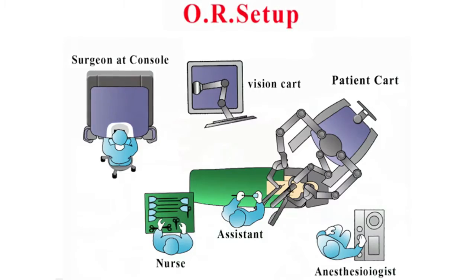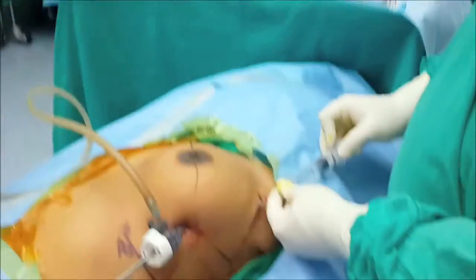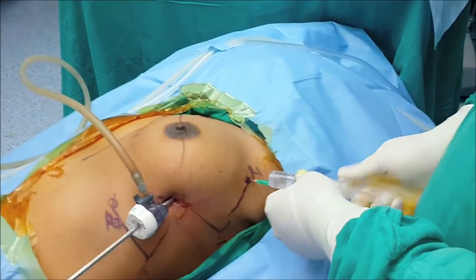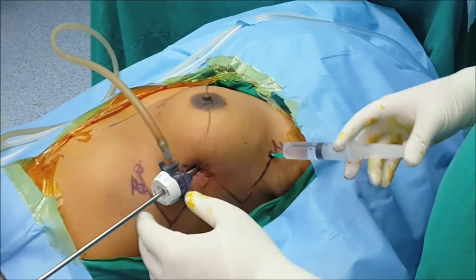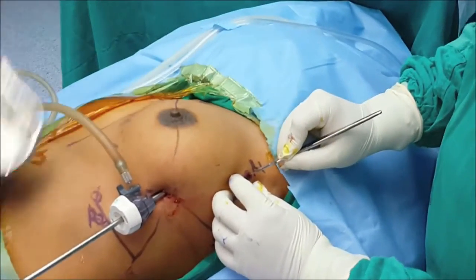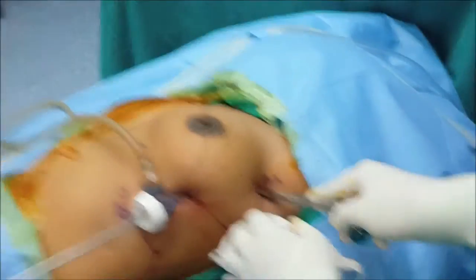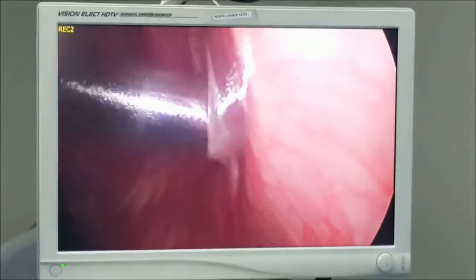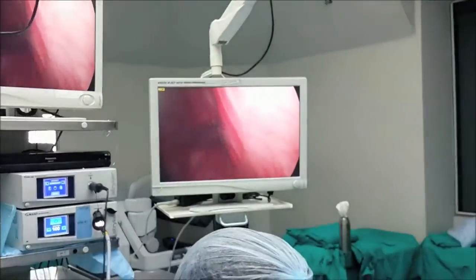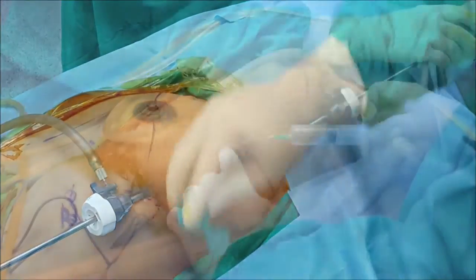Here is a small video. I have already placed a 5mm camera port in the 5th intercostal space. I draw a line across the sternal angle, infiltrate the ports with local anesthesia, and then make a small incision. I suggest not making too big incisions, because that would make the ports loose and difficult to manage. Under vision, we put in our ports. This is the cranial port — arm one — in the 3rd intercostal space, anterior axillary line. It is very important to mark your ports well; you can see completely free movement, absolutely no torque whatsoever.